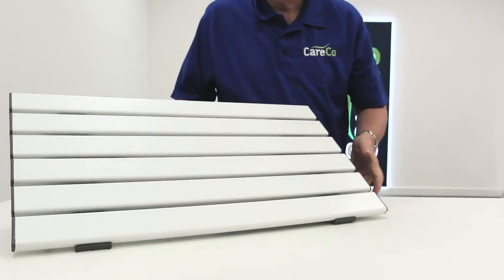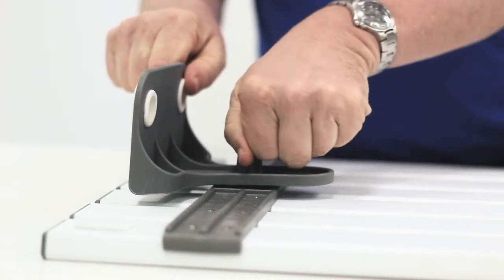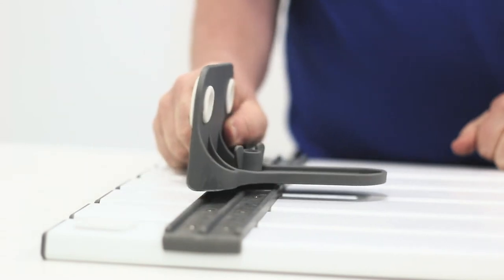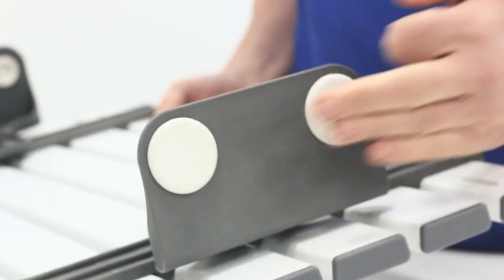The adjustable width of the bath board makes this suitable for all bathtubs. Underneath the board are two brackets that can be altered by loosening the fasteners holding them in place, making sure the board fits snugly into your tub without slippage. There are even rubber pads to prevent the board slipping.